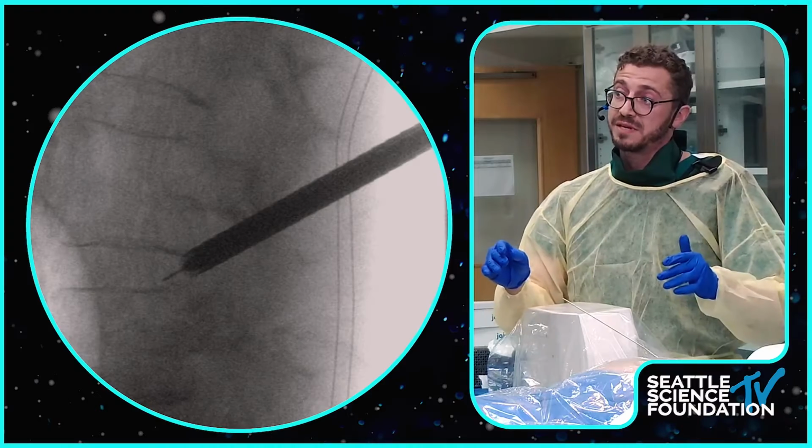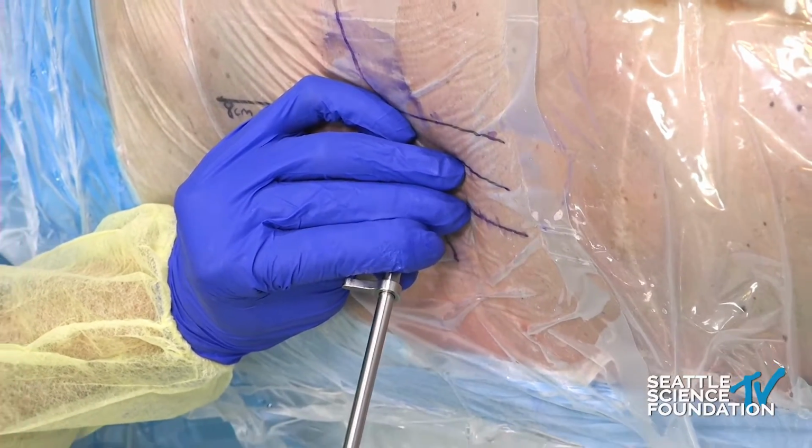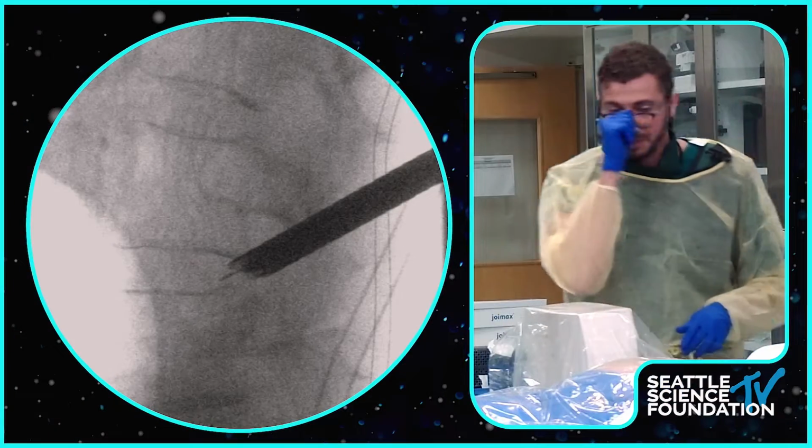Could you take an X-ray, please? So that looks like you're in a good place. So I'm going to pull all the stuff out here. Okay. And take the K-wire out. All right, now can you come back to an AP, please?